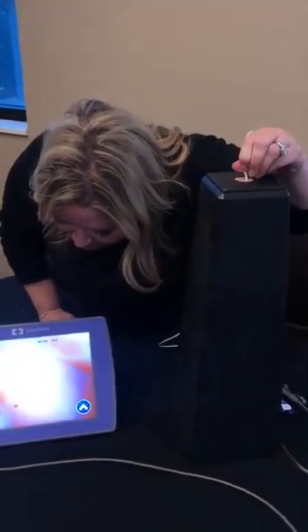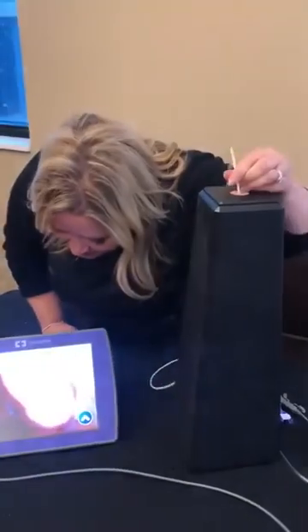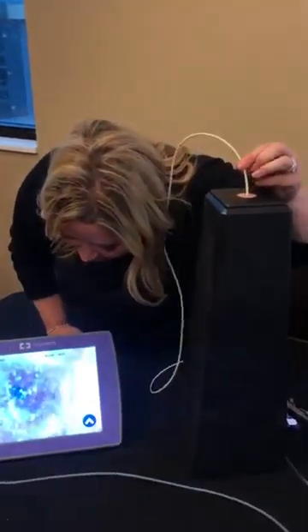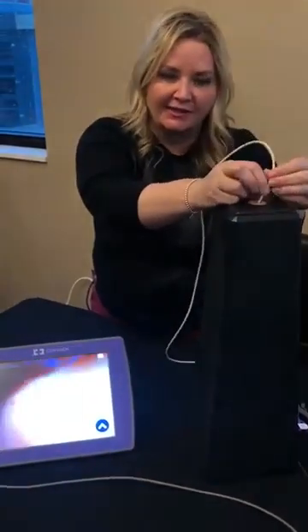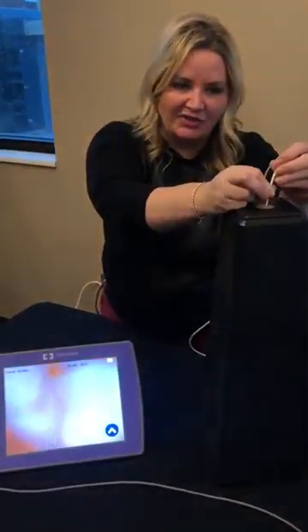How are we looking? You're pressed up against tissue. I'm pressed up against it here. Let me try a little bit different angle. And you all know how challenging this is clinically in patients when we're trying to get tube placement. But once you get past the pylorus, you'll see more smooth muscle, little villi and some bile, indicating that you've made it past that junction.